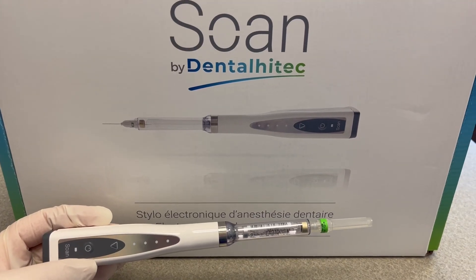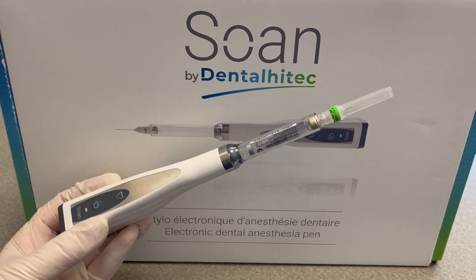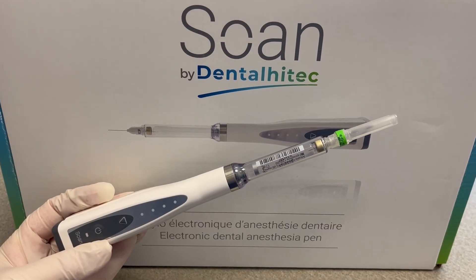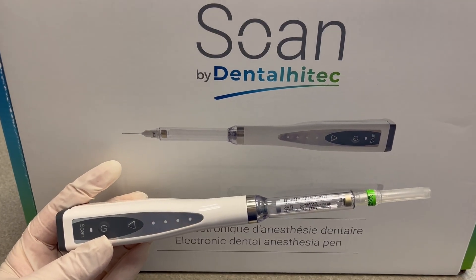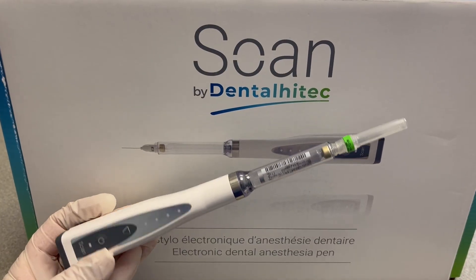This is the Soan electronic dental anesthesia device, which is designed and manufactured in France by Dentalhitec and now distributed in the U.S. by Newsmile. It allows you to give a more comfortable numbing experience for your pediatric patient and deliver intraosseous anesthesia, which allows you to get to work immediately. I'm going to show you how to use this clinically in a pediatric patient.